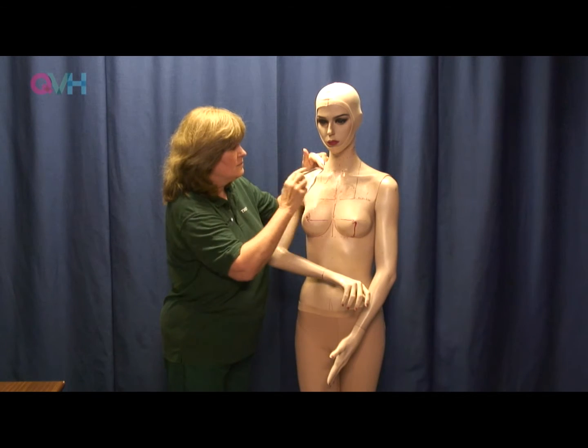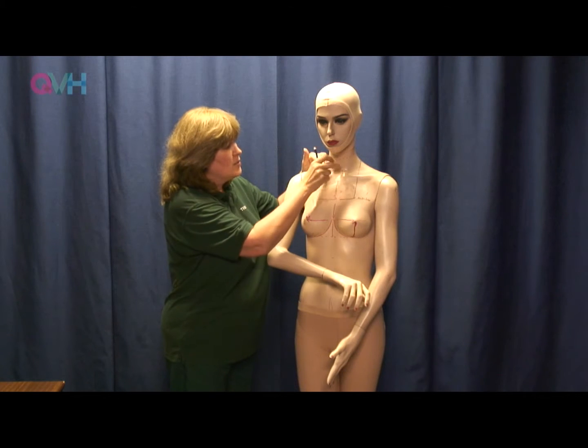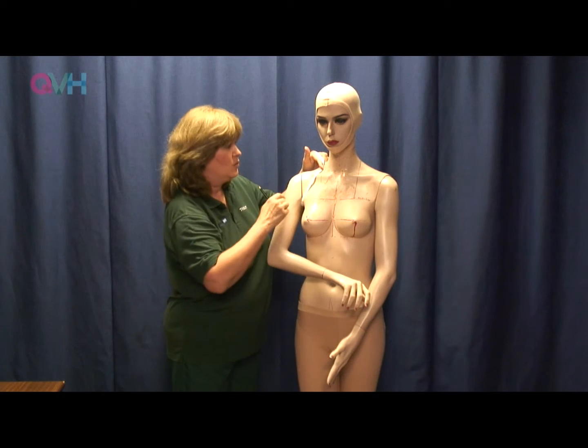But that would be to that point that we can envisage the neckline would naturally sit, a neckline of a vest. Not quite where we measured, but that's where it will drop to and sit in order to give coverage of shoulders and chest and axilla when you're treating those areas.